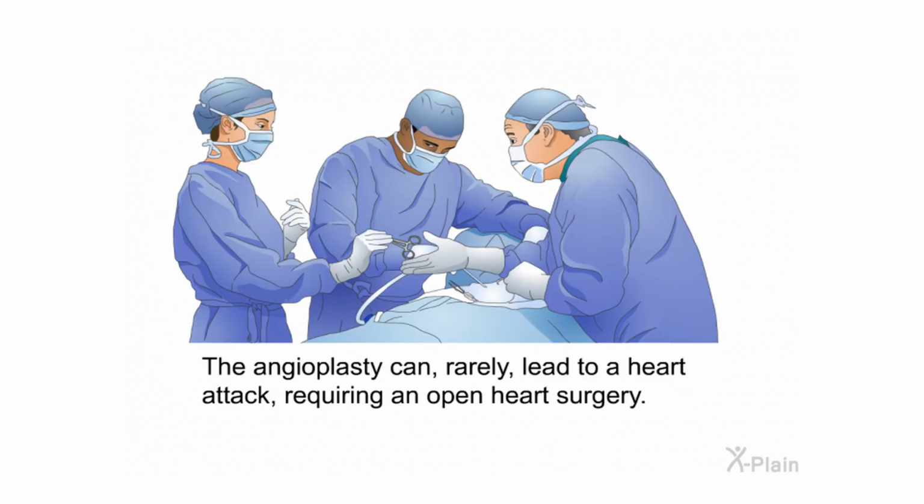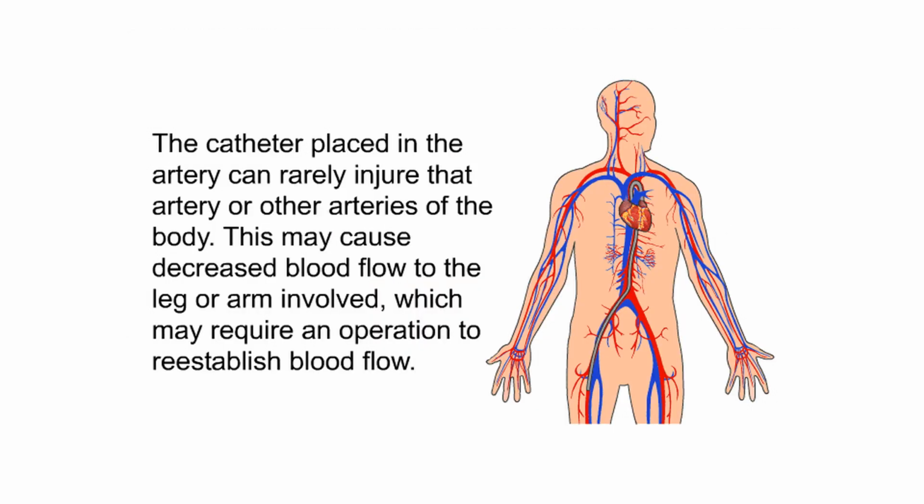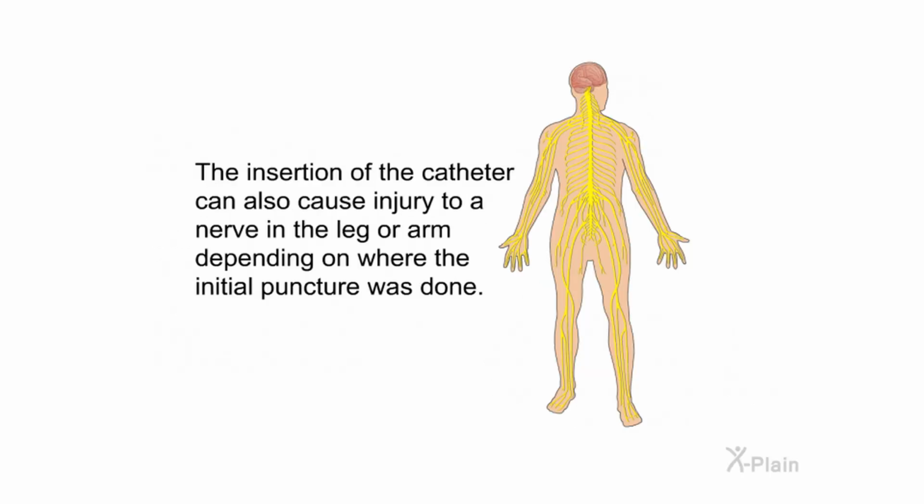The angioplasty can rarely lead to a heart attack requiring an open heart surgery. The catheter placed in the artery can rarely injure that artery or other arteries of the body. This may cause decreased blood flow to the leg or arm involved, which may require an operation to re-establish blood flow. The insertion of the catheter can also cause injury to a nerve in the leg or arm depending on where the initial puncture was done.